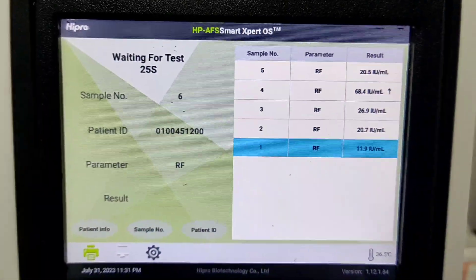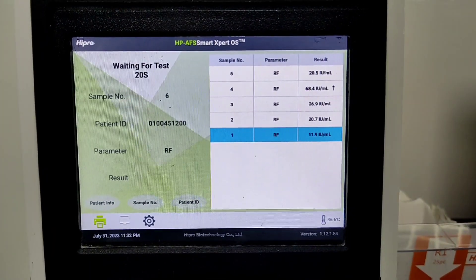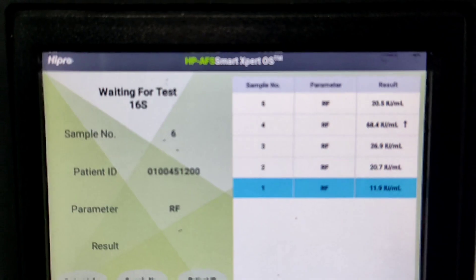Then it will display time on the screen. One important fact to be considered while performing this test is that due to the impact of evaporation, we have to complete the test immediately once the capillary is full of samples.